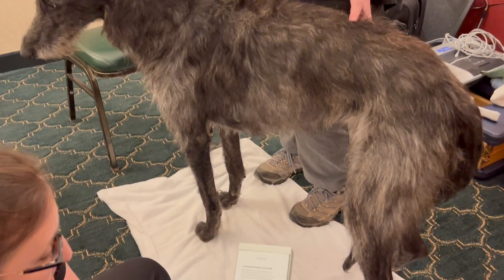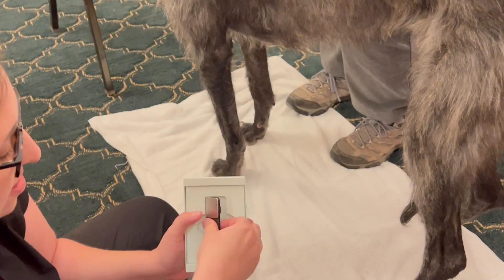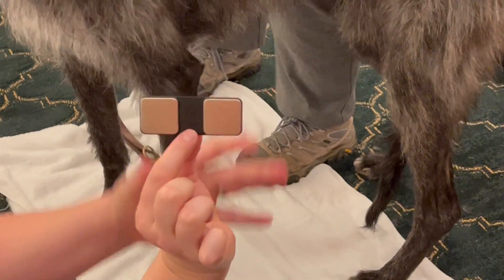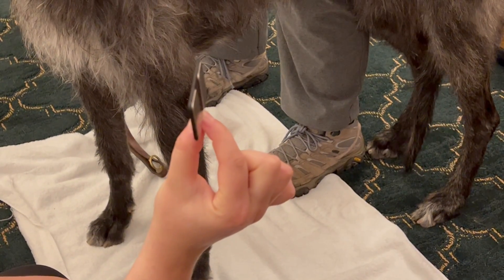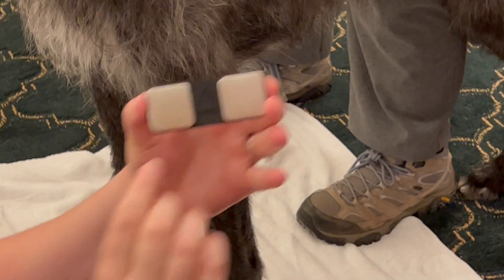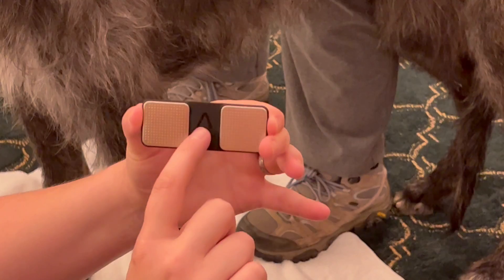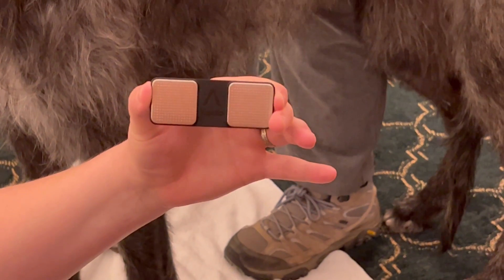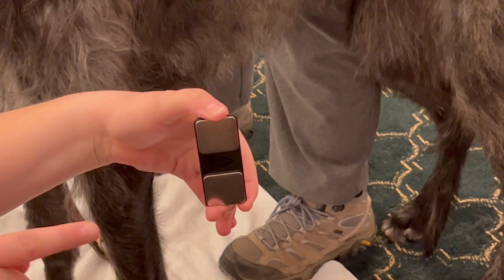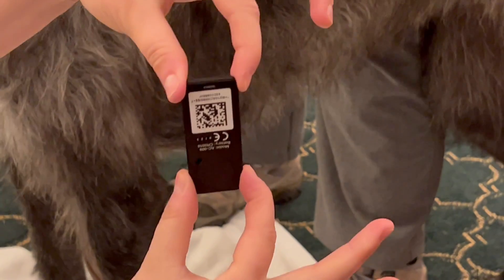This is the box it comes in. There are instructions if you need them, and this is all that it is — it's about this big and thin. The battery is already in place and will last a long time, so no additional batteries are needed. There is a little symbol that almost looks like an arrowhead, and that is going to be held towards the tail of the dog. These are the electrodes that need to make contact with the dog's fur.